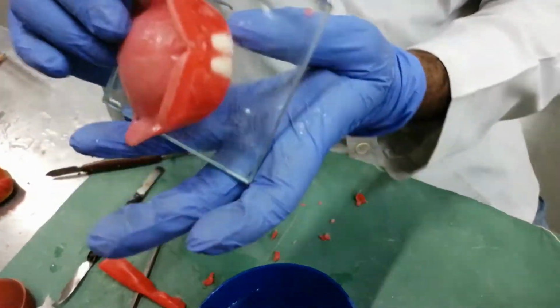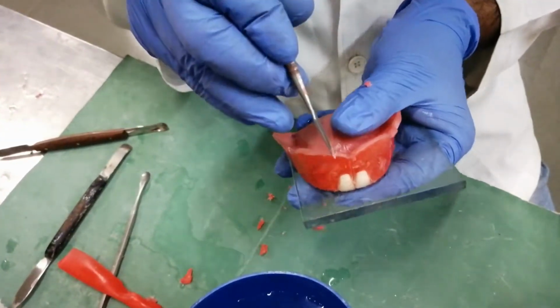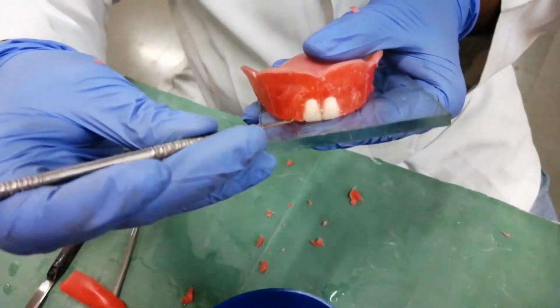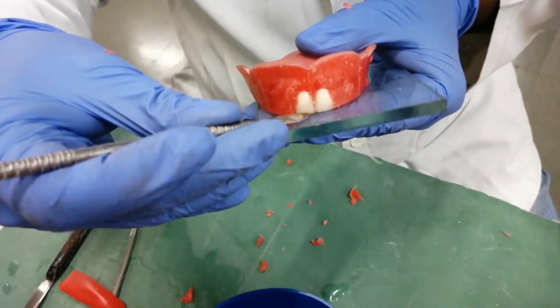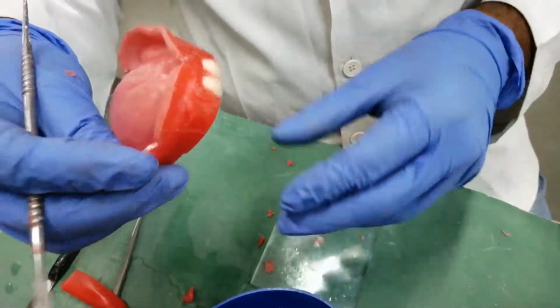Now we will see the teeth inclinations. According to that, central incisors' incisor edges should touch the glass slab. At the same time, the entire rim should touch the glass slab. Long axis of the central incisor should be perpendicular to the glass plate.